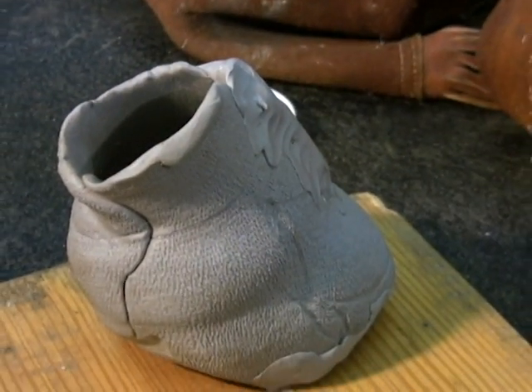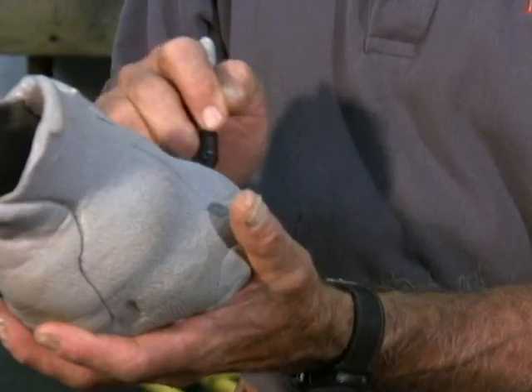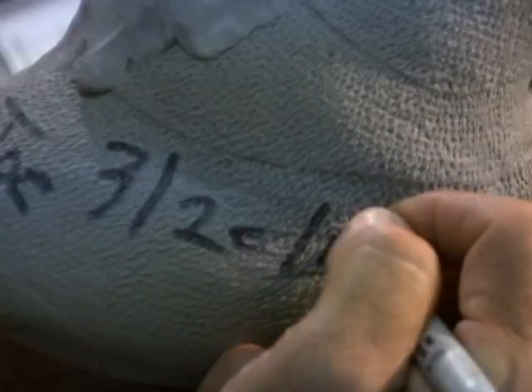Once your mold is completely cured, your finished product should look like this and will sit upright, ready to have the smooth cast poured into it for the positive. Now write the horse's name, date, and foot identity on the negative mold with a Sharpie, and it's ready to be shipped.